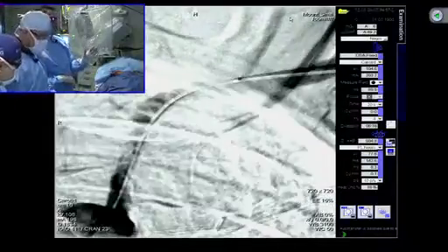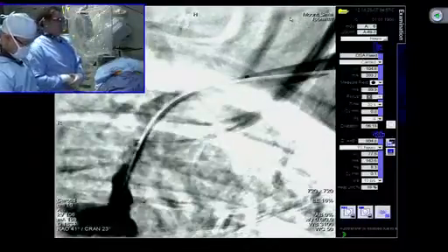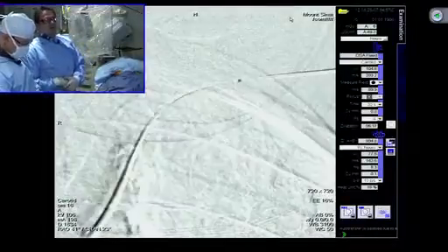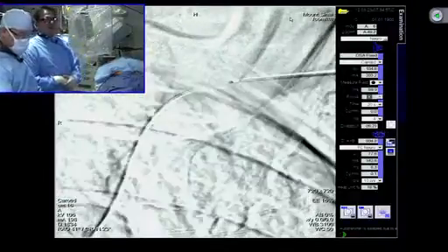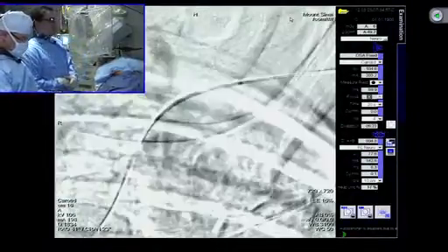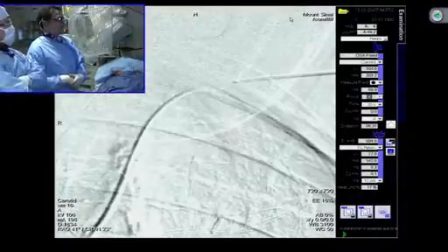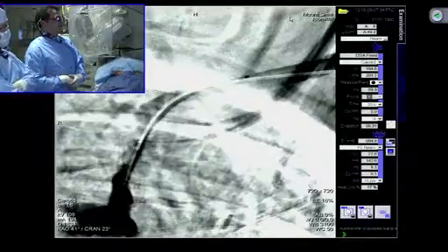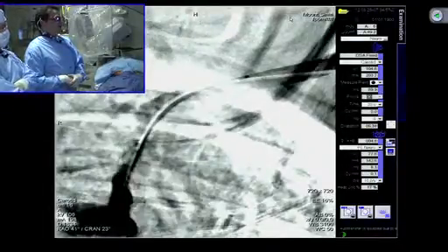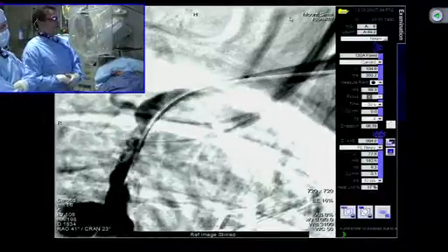So here, there are certain views that are essential in subclavian artery intervention. And one of the views that we use very, very commonly, and is used not only by us but everybody out there, is the RAO cranial view. And if I can ask Ray to toggle this image so we can show you a little better, the lady's obviously breathing, but in an RAO cranial view you can see both the vertebral artery above, and you'll see the LIMA shooting down below. There's a good image of the vertebral artery. I don't know if you can see it, which is very, very clear.